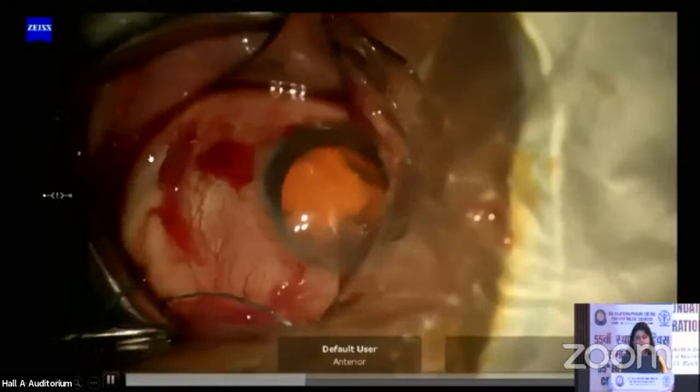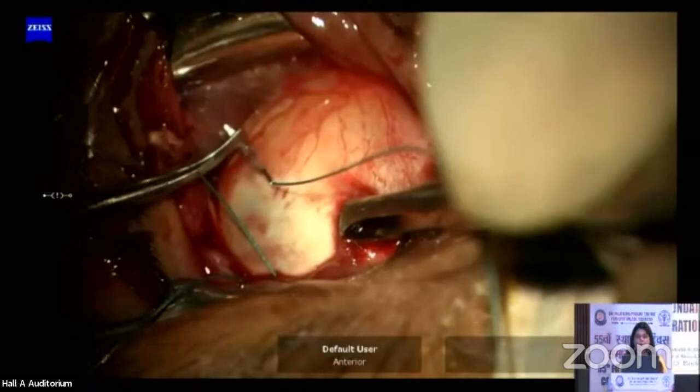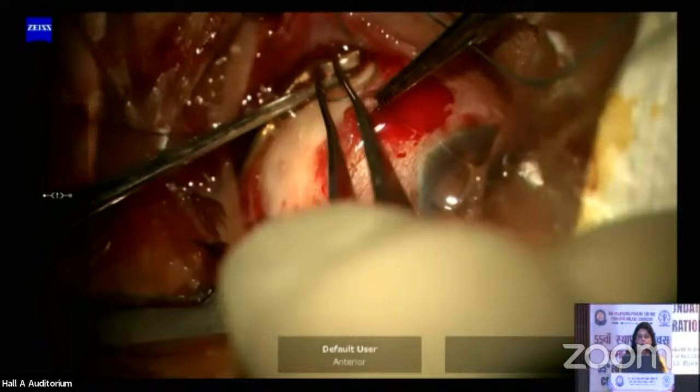Once this has been done, you can see that we have to be very cautious while putting this suture, because it is a partial thickness scleral suture, and we have to take all precautions that the sclera is not perforated. Now this is actually the radioactive plaque which is being placed. This is a very important step. We have already secured the position using our dummy plaque. We removed the dummy plaque, the sutures were in place, and now we are putting the radioactive plaque. We have to try to minimize exposure of the whole team to radioactivity, which is why we try to be very quick with this part of the procedure.